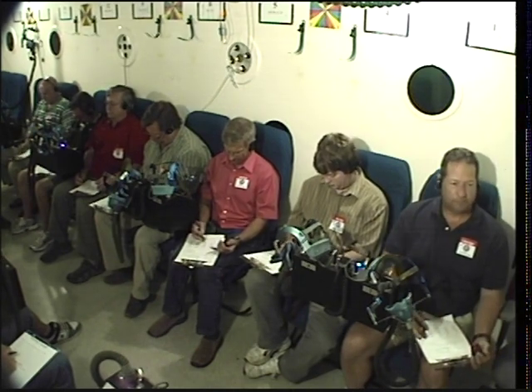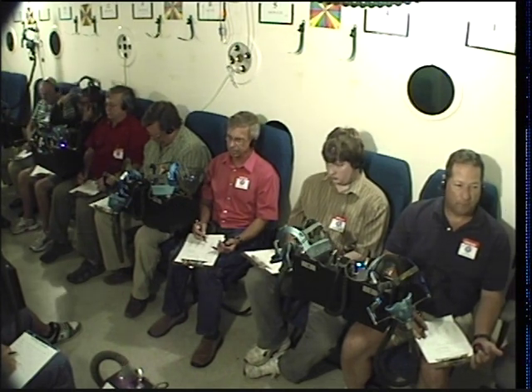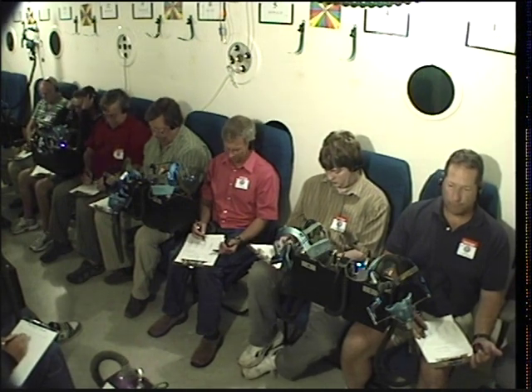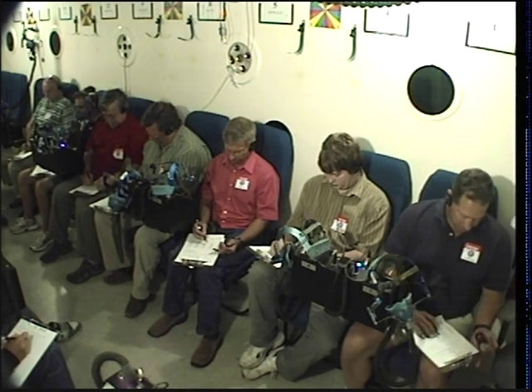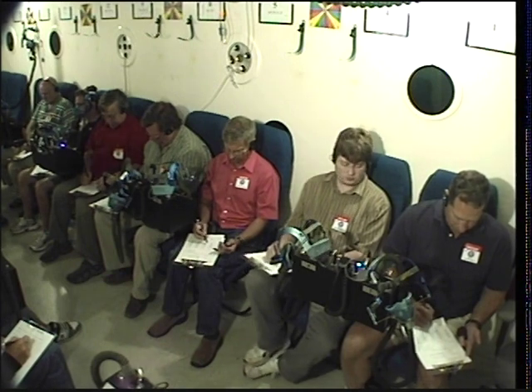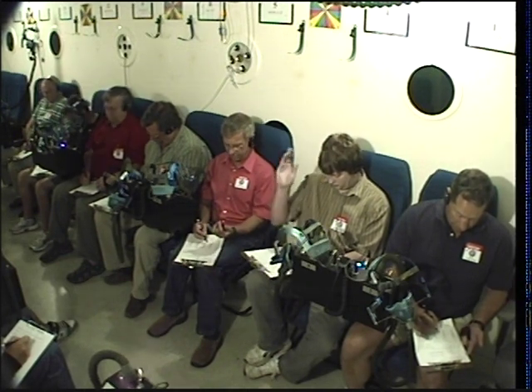All right, we are going to continue the demo. Of course, we've got Chris and Hal. You're both watching Dan down there, taking notes on him. We've got 12 going back on. And we are at 2 minutes for the rest of us. So go down to item number 4 if you have your mask off. Put a check mark by the symptoms that apply to you right now, and also take a pulse oximeter reading. Looking at your pulse oximeter, is there anybody in the 60s? Raise your hand if you're in the 60s.